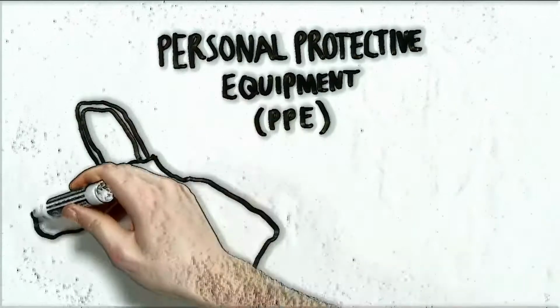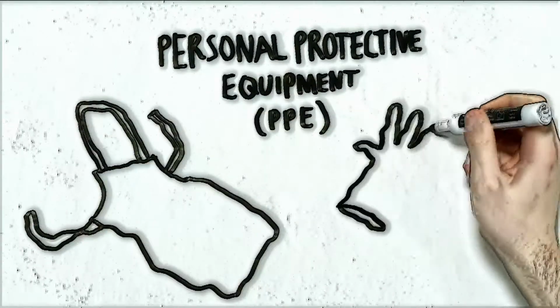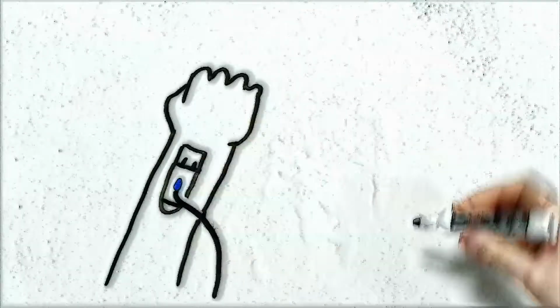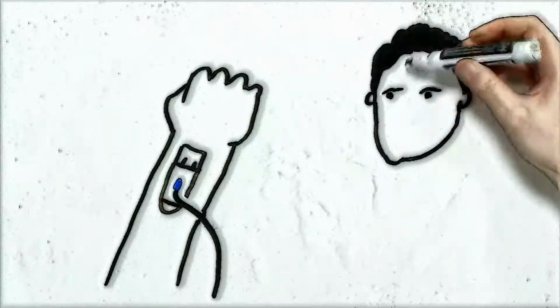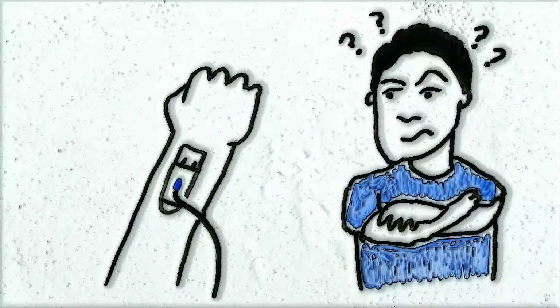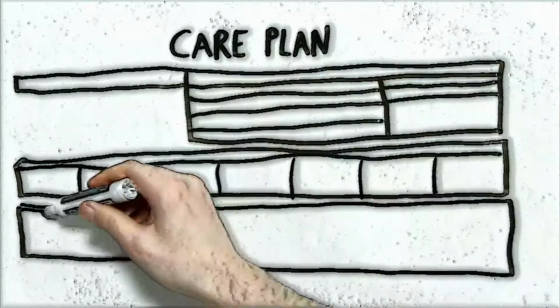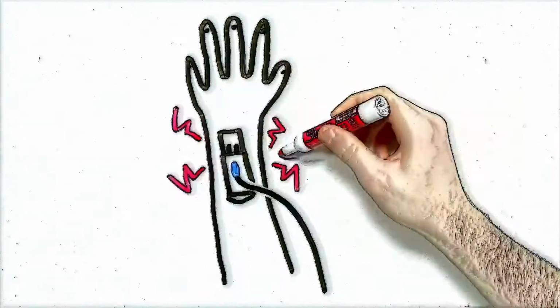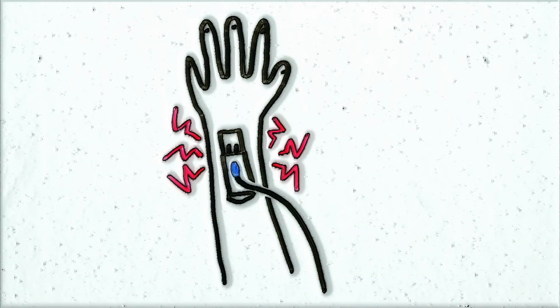Gloves and an apron should be worn when inserting a PVC to prevent contamination and to protect the staff member. Following insertion, a transparent semi-permeable dressing should be used to allow easy inspection. A PVC care plan must be completed by the person who inserts the PVC, and this will be checked daily to observe for any signs of infection, for example, pain, redness or swelling.